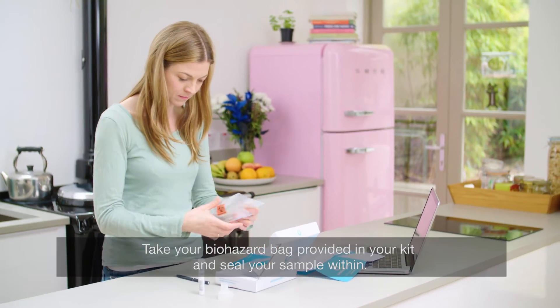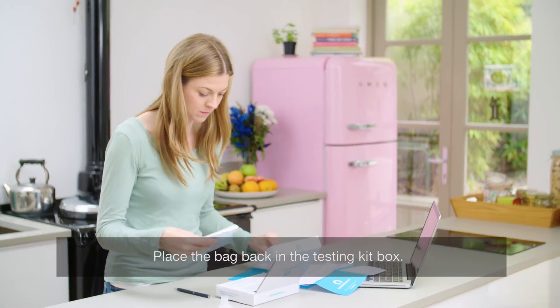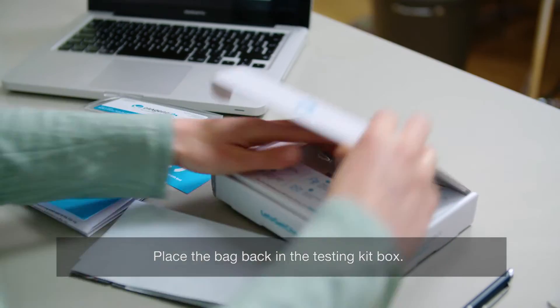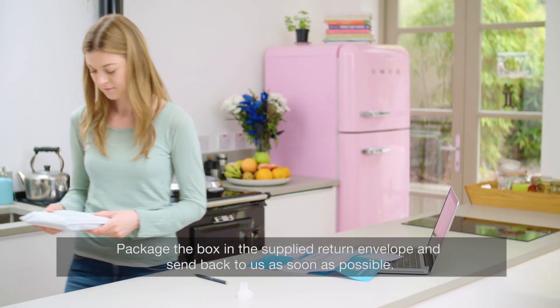Take your biohazard bag provided in your kit and seal your sample within. Place the bag back in the testing kit box. Package the box in the supplied return envelope and send back to us as soon as possible.